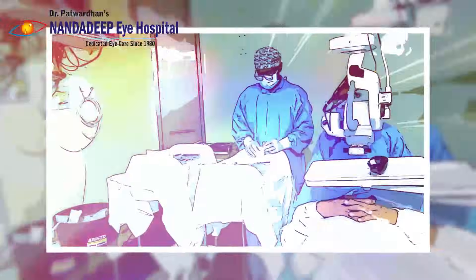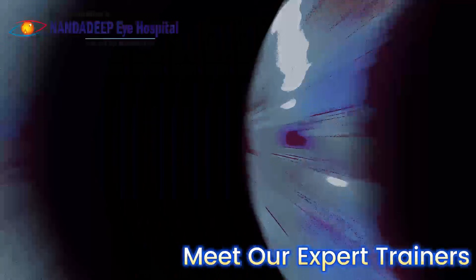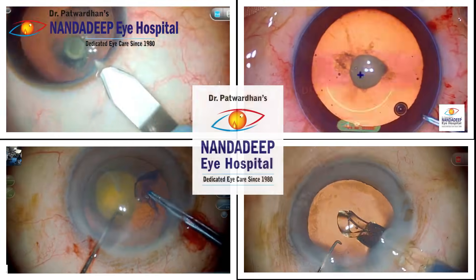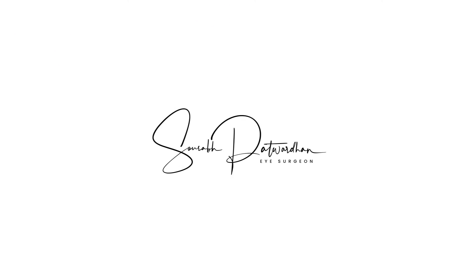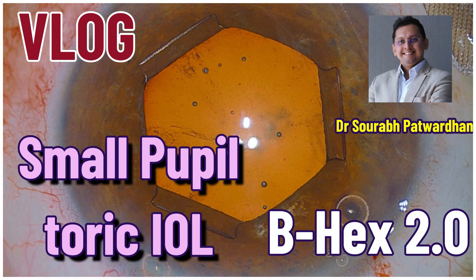Welcome to Nandadipai Hospital, a center for surgical excellence where we also train colleagues in different ophthalmic surgeries. In this video, I will be dealing with a case of small pupil where I have planned a toric IOL insertion.